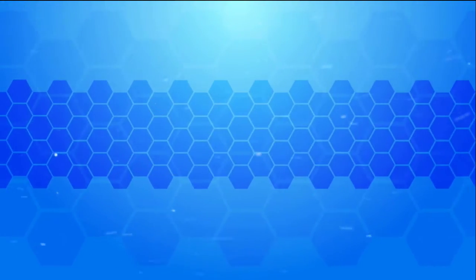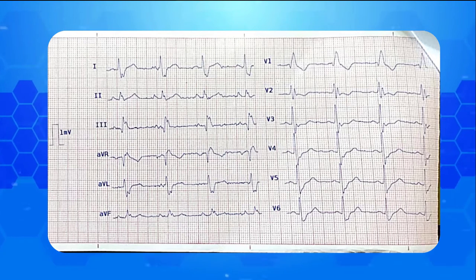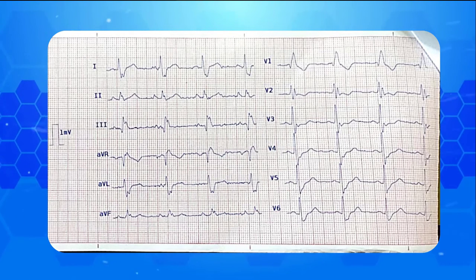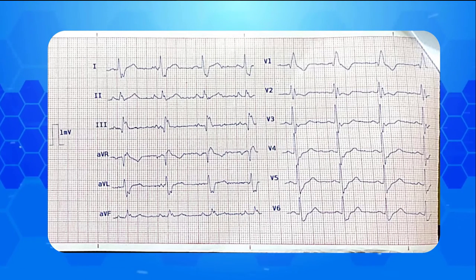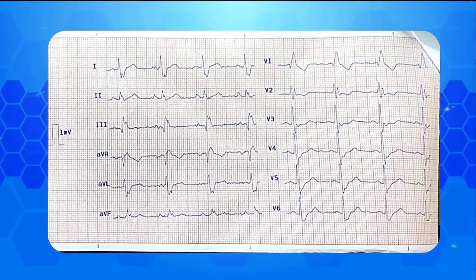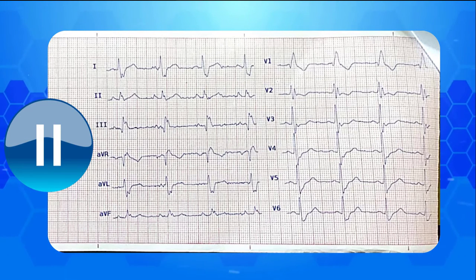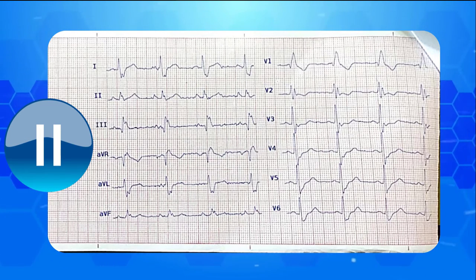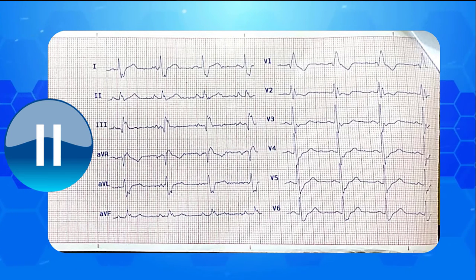Let's go through further examples. Here's another EKG for you. What do you see in this electrocardiogram? Pause the video and write your own interpretation. Then play the video again and check your answer with the correct one.